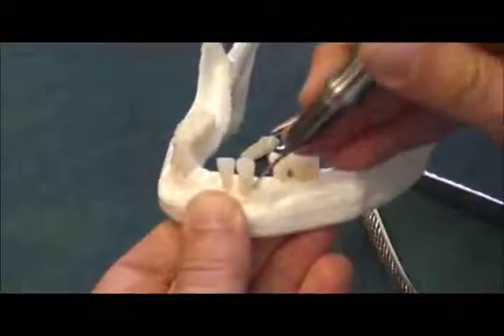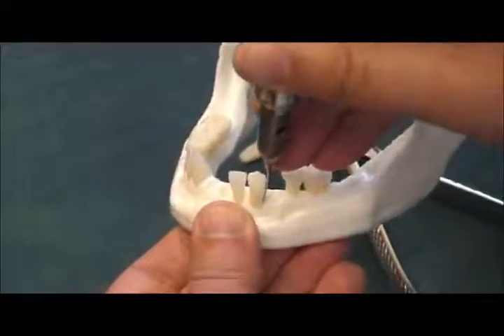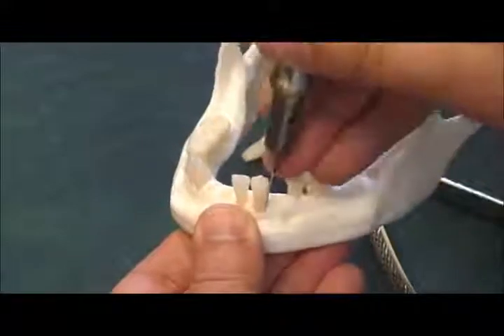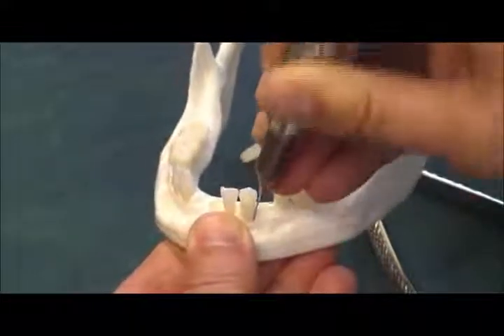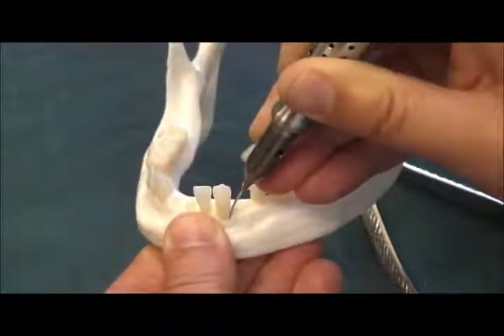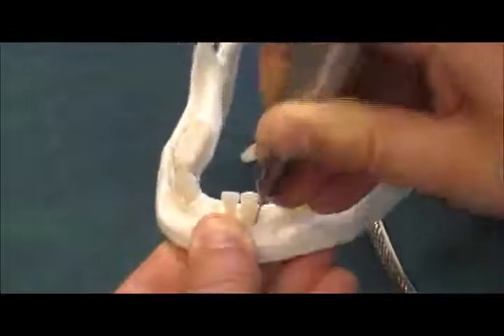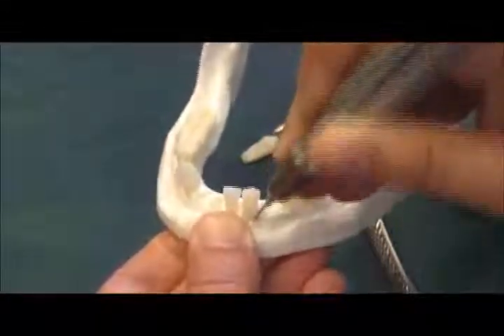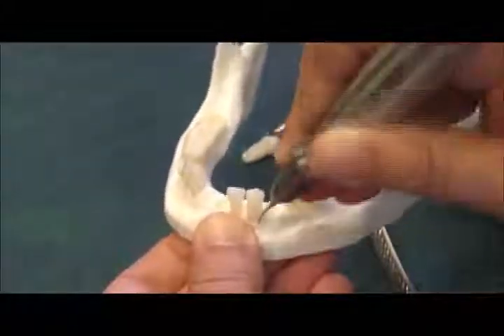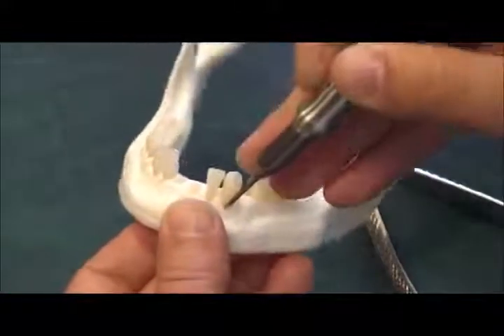So what you'll notice will happen is you'll be going like this and the tip's not advancing. Well, if you just stand it straight up and then start your sweeping motion like this, little by little the socket's going to expand. But as soon as you increase that angle, you're less efficient. More efficient, less efficient. You can even tell the difference in the noise. So just keep sweeping back and forth, and I'm on the distal buccal line angle of the canine there. And this model is very, very close to what it feels like on an actual patient.